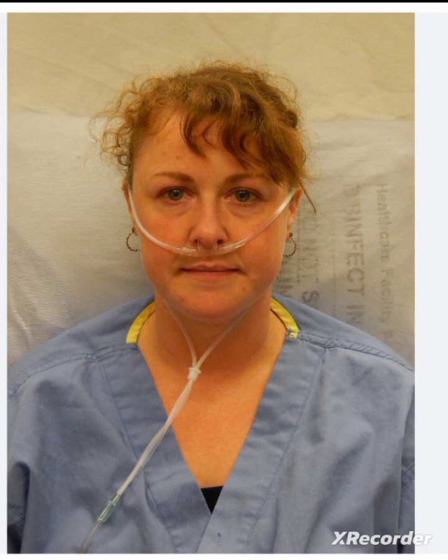You can see in this picture, it is a commonly used device, and it is safe, simple, acceptable and comfortable for the patient. This nasal cannula is useful for patients requiring low O2 concentration. It allows the patient to move about in bed. Especially, the patient can eat, talk or cough while wearing this device. That is the main peculiarity of this nasal cannula, and it is low flow and most commonly used.